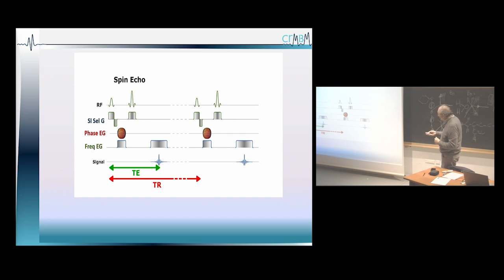And so you've got a combination of different gradients in here. You are going to repeat the experiment several times, and the idea is that you are going to cover the entire image. At the end, you can reconstruct the image. But it will be the same: you need the magnetization change over time, and you are going to do Fourier transformation, exactly the same.